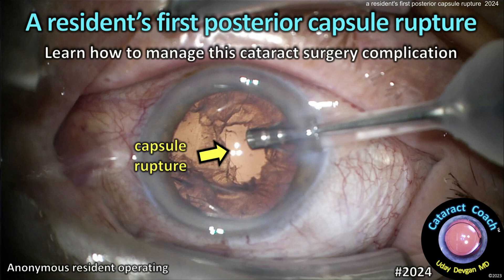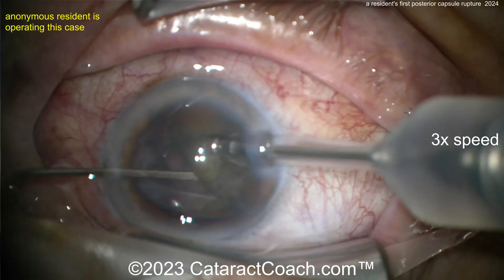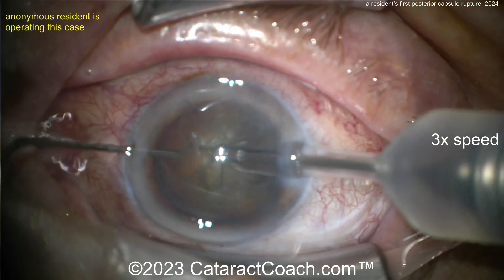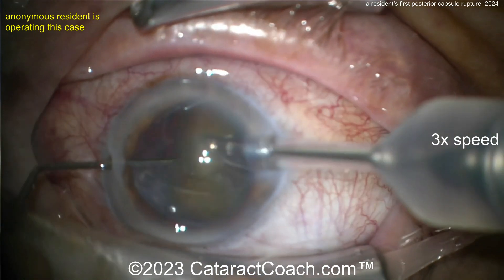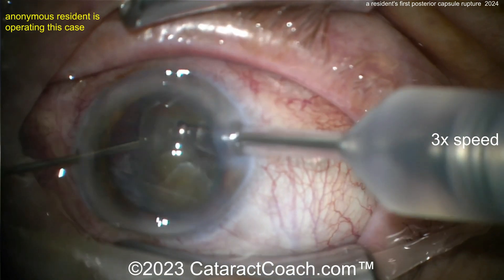Cataractcoach.com presents a resident's first posterior capsule rupture — learn how to manage this cataract surgery complication. An anonymous resident is operating, sitting superiorly, taking out the nucleus with the phaco probe. The lid speculum on the lower lid has come off the lid margin.